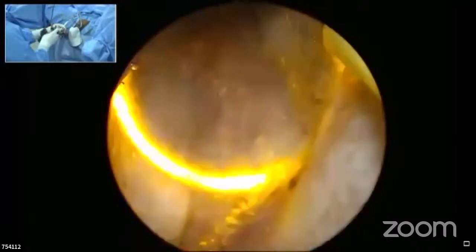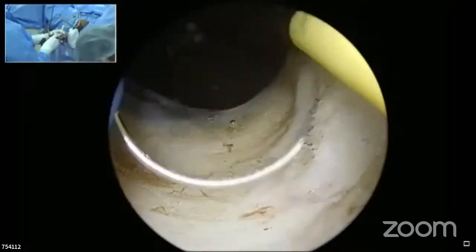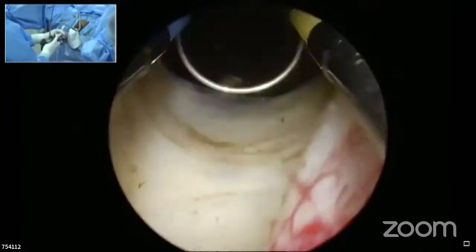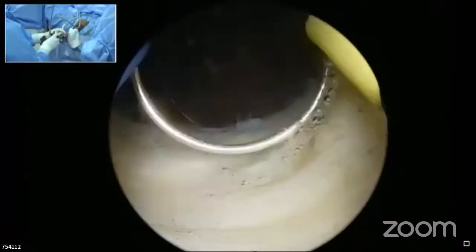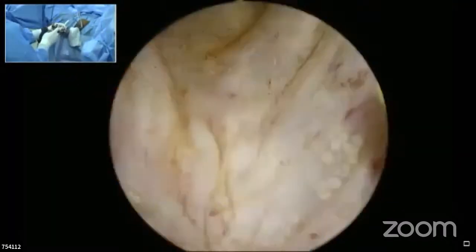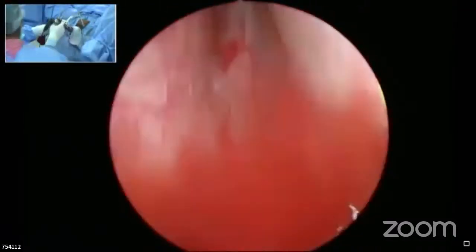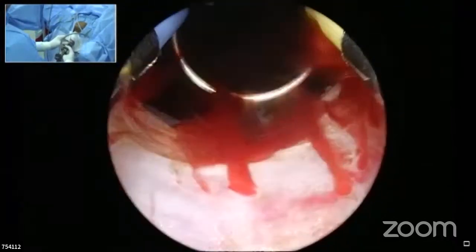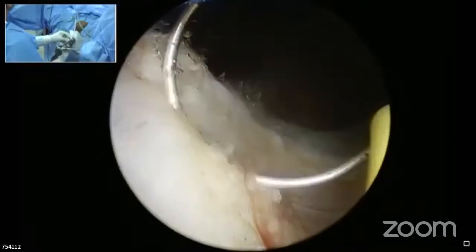The principles are the same as discussed in the previous case, making the groove till we reach the bladder neck fibers, basically to identify the arteries and cut off the supply to the median lobe. Taking care that we don't over resect in these initial few minutes, risking undermining and subtrigonization, which increases the risk of extravasation of the fluid right up front. So that is one thing that happens in the initial few moments of the surgery, increasing the risk of a higher amount of extravasation.